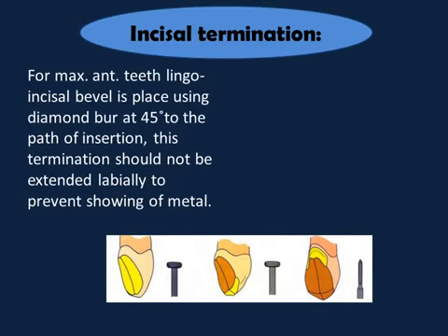We should place a lingual incisal bevel using a diamond bur at 45 degrees to the path of insertion, and this termination should not be extended labially to prevent showing of the metal, as you see in the picture, the lingual incisal bevel.